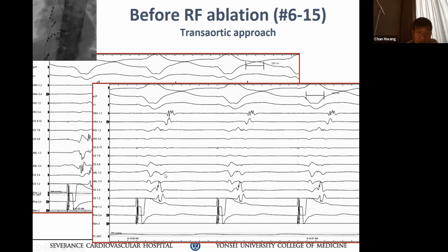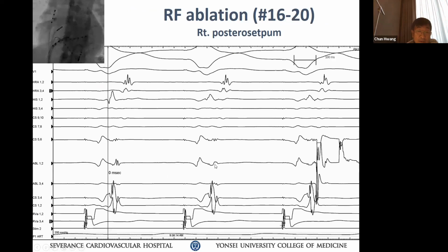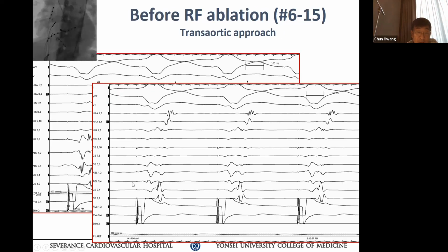오케이. Alright. 근데 그 돌아가봐 거기. 여기 보면은 ablation proximal하고 distal하고 which way you think is early? ablation proximal 팍 조그만 거 보이잖아. 봤어 그거? Right there. They're on time.